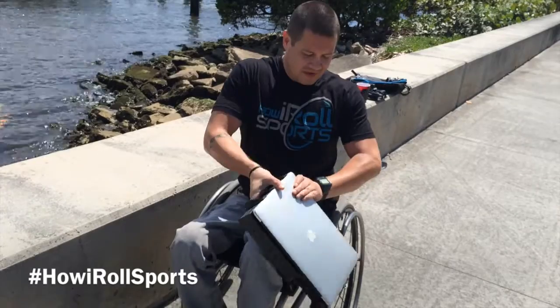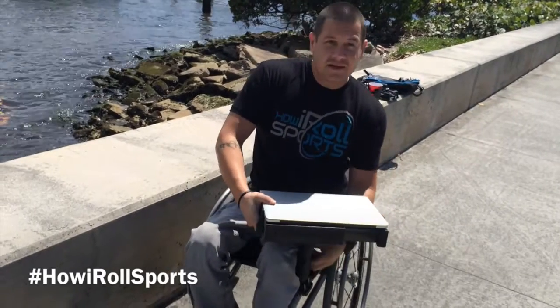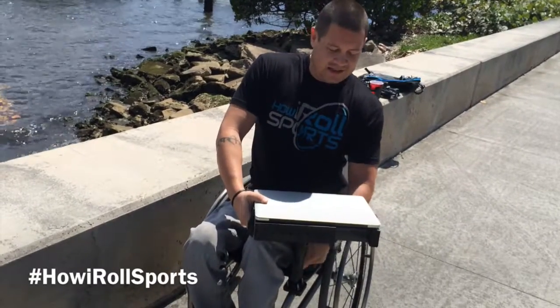Now a hands-free computer wheelchair mount. Get it how it works for you.